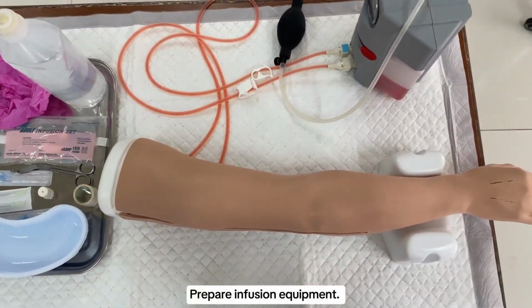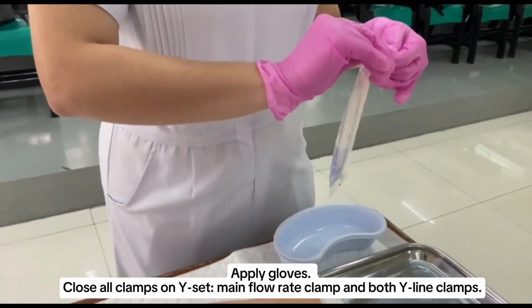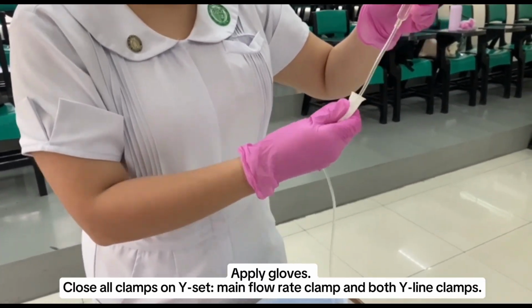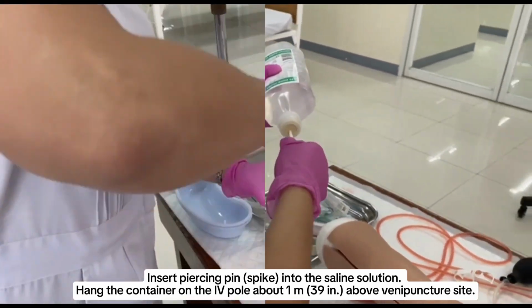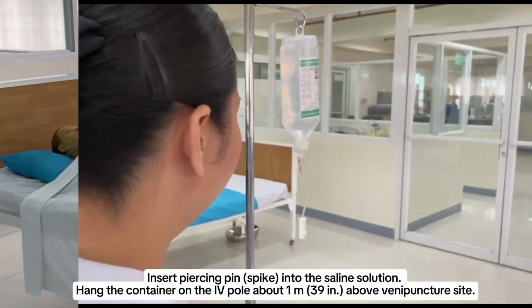Prepare infusion equipment. Apply gloves. Close all clamps on the Y set: the main flow rate clamp and both Y-line clamps. Insert the piercing pin into the saline solution. Hang the container on the IV pole about 1 meter or 39 inches above the venipuncture site.